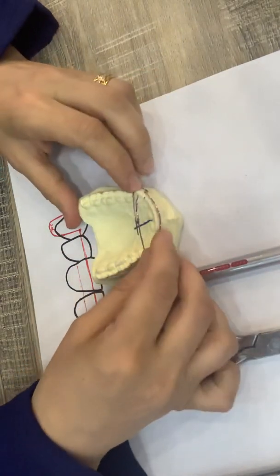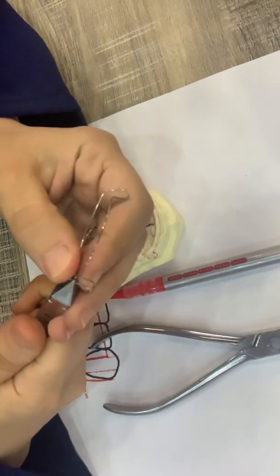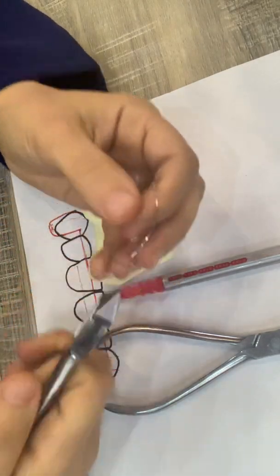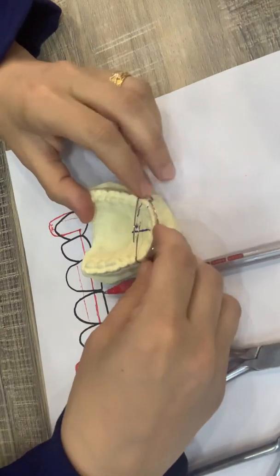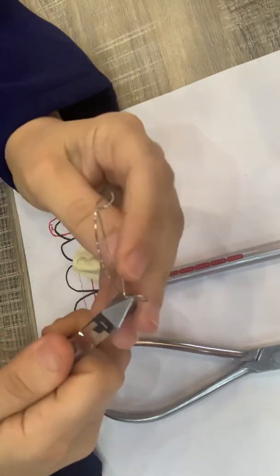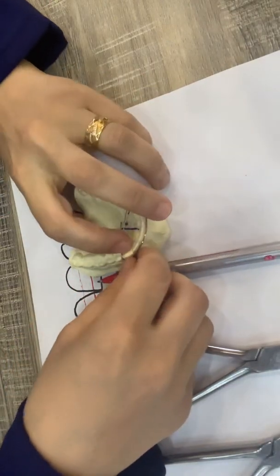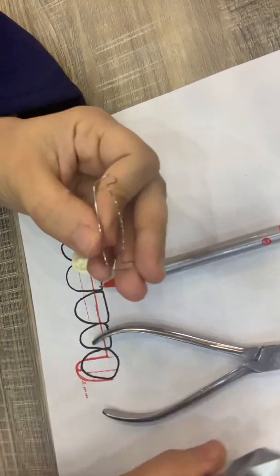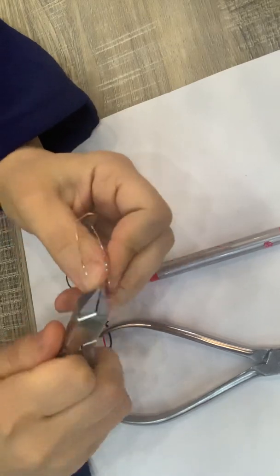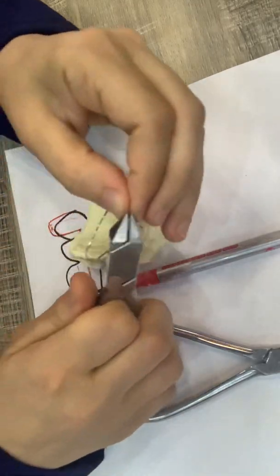Now we continue with the occlusal part. We do adaptation on the occlusal part, and adaptation for the retentive arm, and making the L shape.